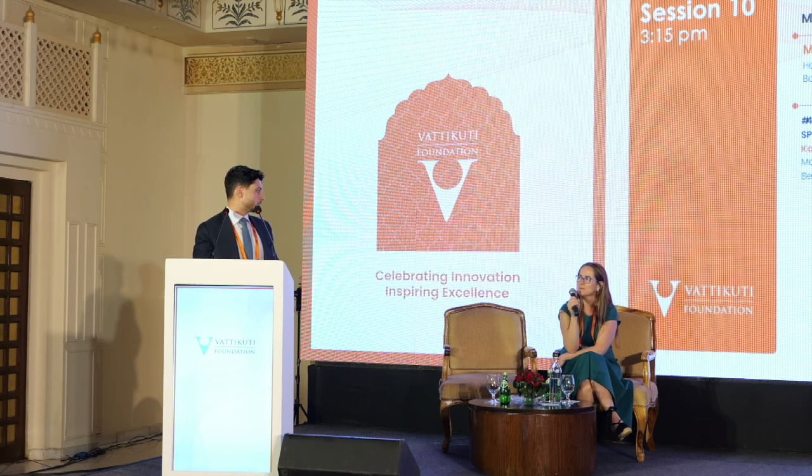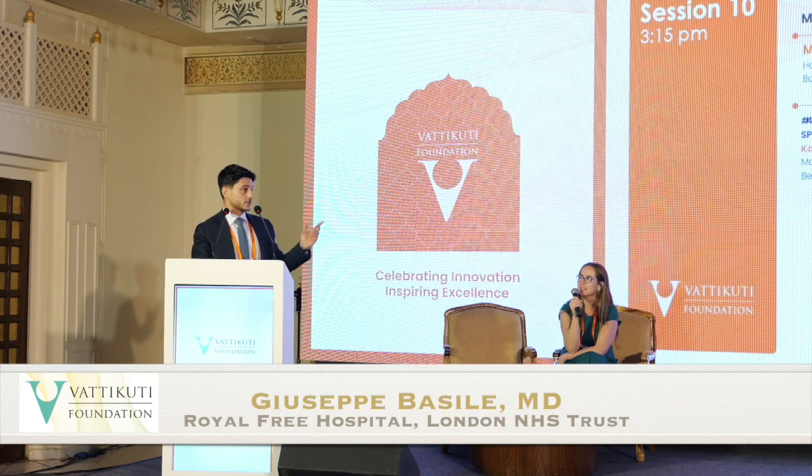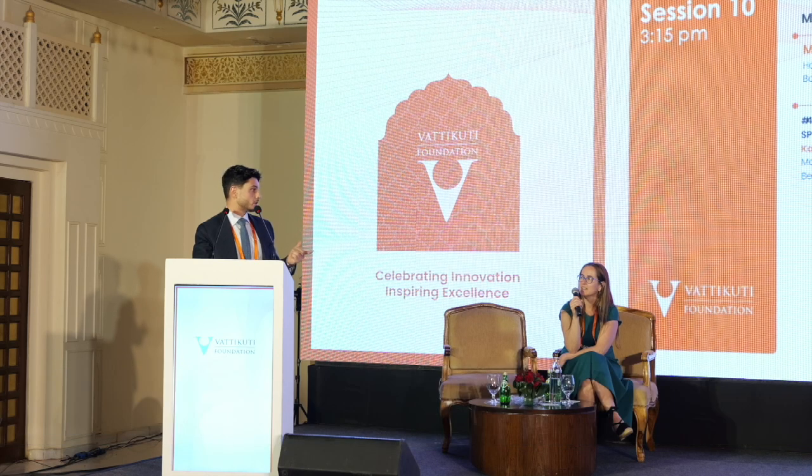Okay, we use an intra-abdominal probe just to assess. Actually, in all the cases we use the intraoperative probe to assess intraoperative Doppler. You know, 7 cases were done with living donor kidneys, so we need to be sure that that kidney was working. So we always use the intraoperative probe to assess the Doppler.